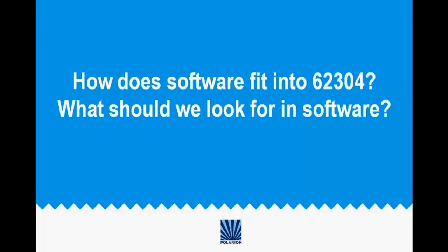Let's assume that you are the integrator. You have responsibility for both the hardware and the firmware, everything inside that product. You cannot pass that responsibility for understanding what that is off to someone else. Now, you may not have direct engineering understanding of what's in there, but you have an obligation to show due diligence and confirm that you've been attempting to get appropriate levels of engineering understanding of that particular component, and have an understanding of how that component integrates into your system, and how that component, when it fails, or in some manner, will impact the rest of your particular system.